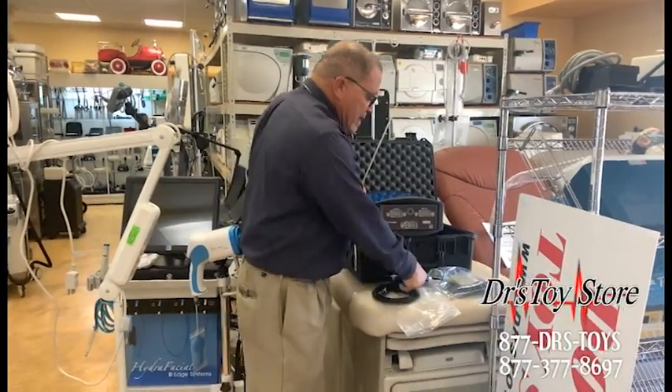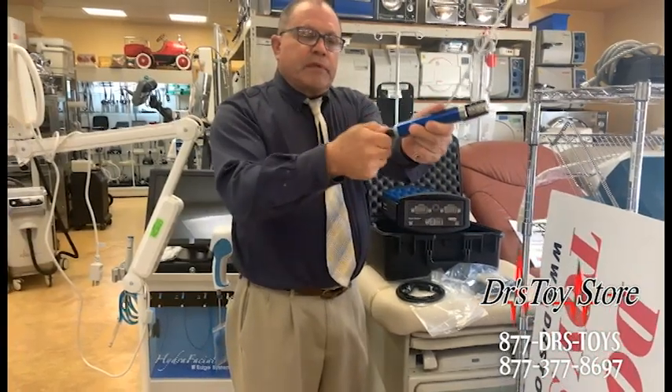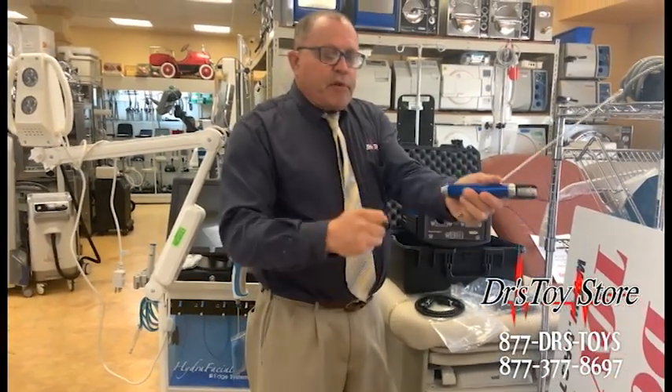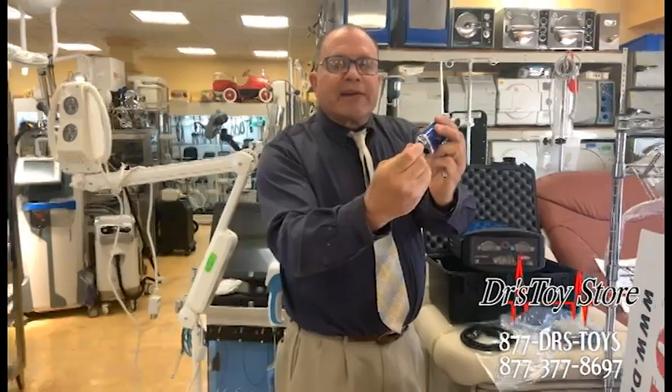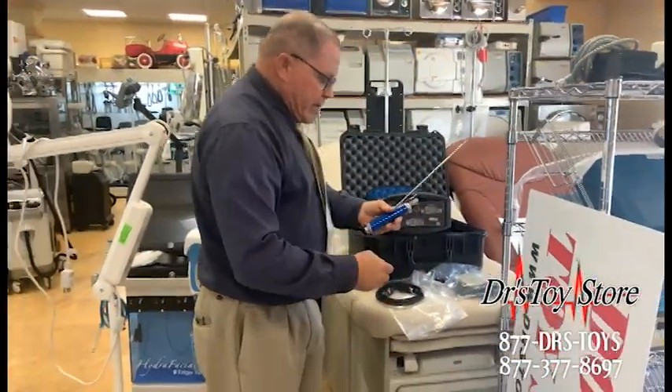A quick little tutorial on the PureSculpt. These little things — little caps or whatever you call them — go over where you put the electrical in when you sterilize the instrument, okay?